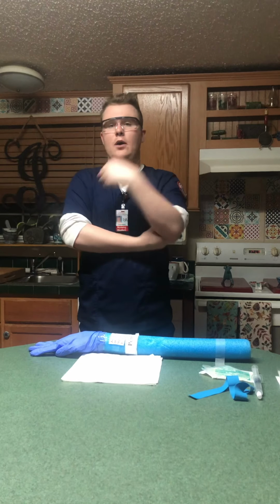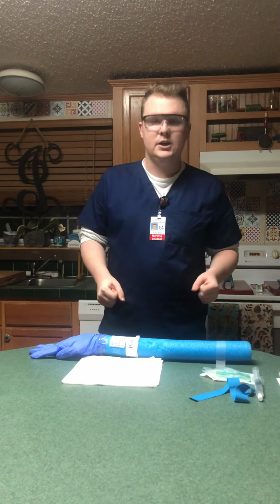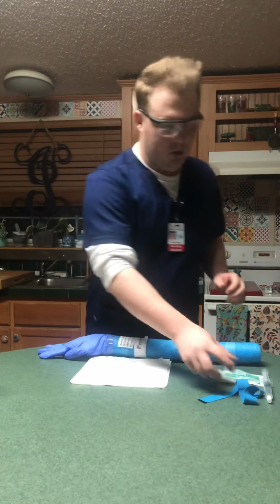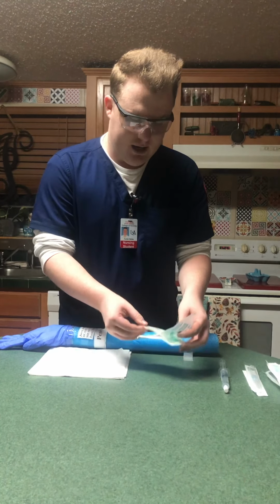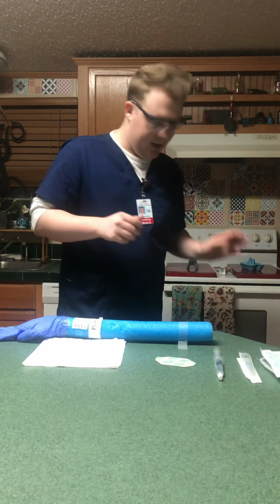Okay, so now I'm going to raise the bed up to a comfortable working height, lower the side rail, and put my patient either in supine position or sitting. After they're in the correct position, I'm going to take my equipment and open it using sterile technique. So I'm going to open my Tegaderm, and I can just set this down. I'm going to drop this.